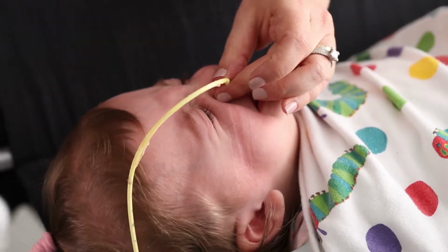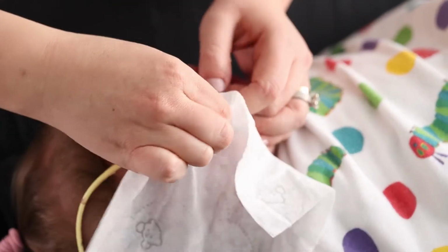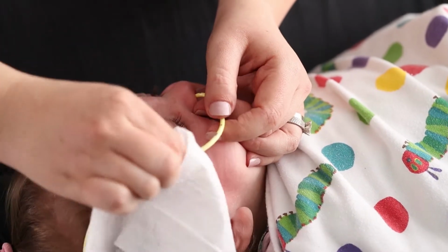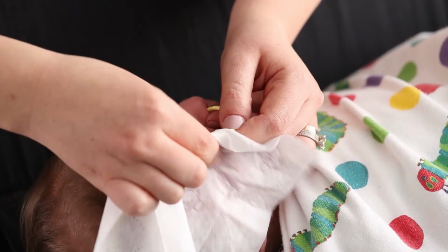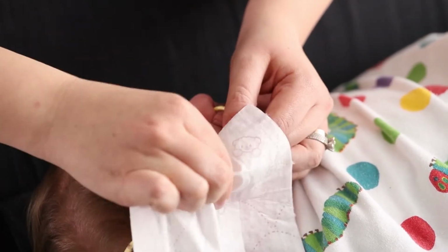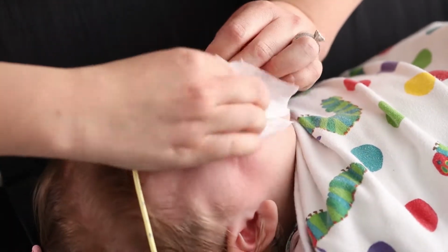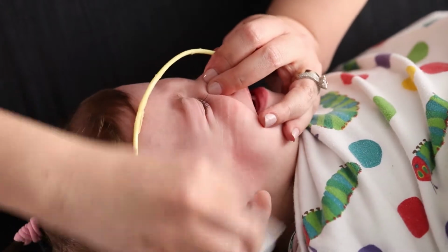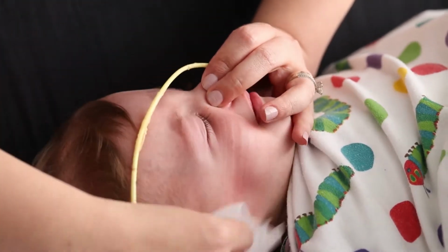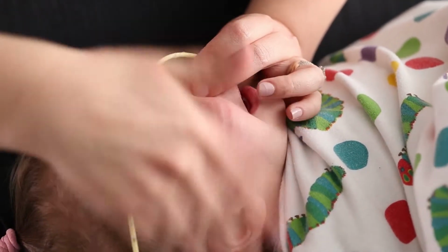I just get usually a wet one and I get the excess off a little bit. Good girl, Emily. Emily is not in any kind of pain, but it's just uncomfortable for them. That's all. Okay, so what else I do with the wet one? I just wipe her skin down, just make sure there's no residue on her actual skin itself as well. Okay, I let that dry a little bit.